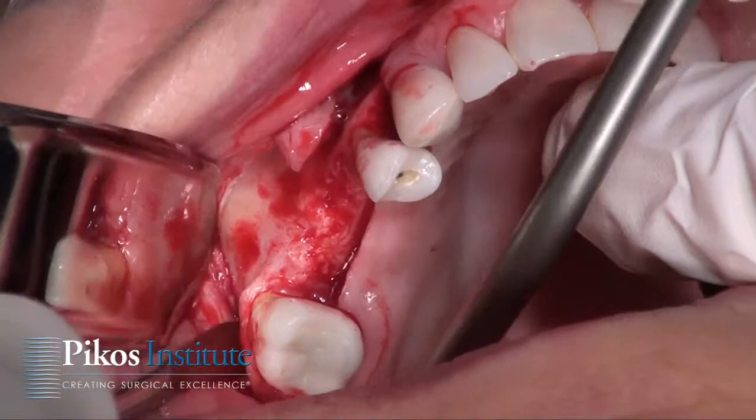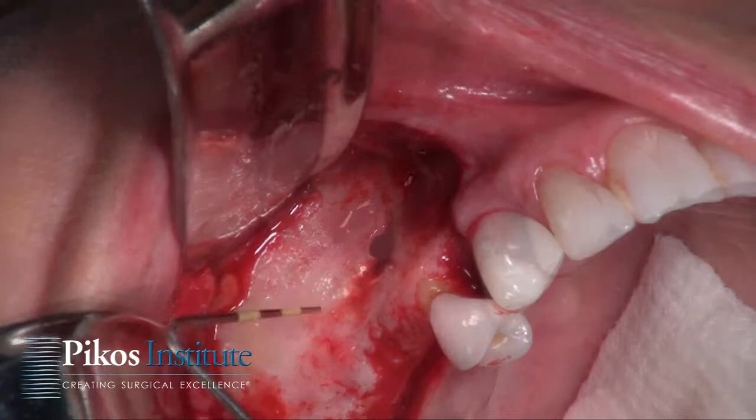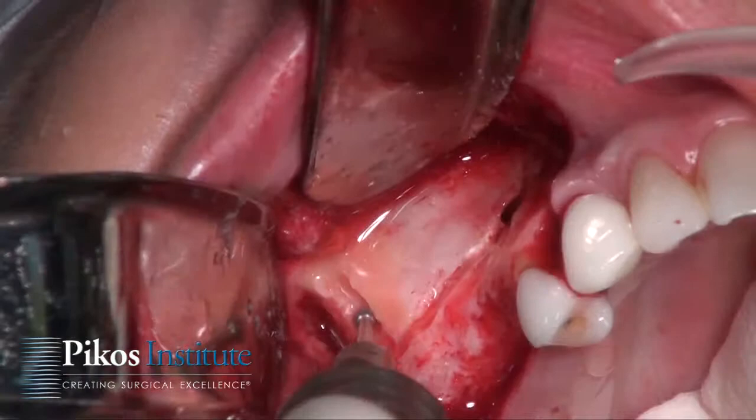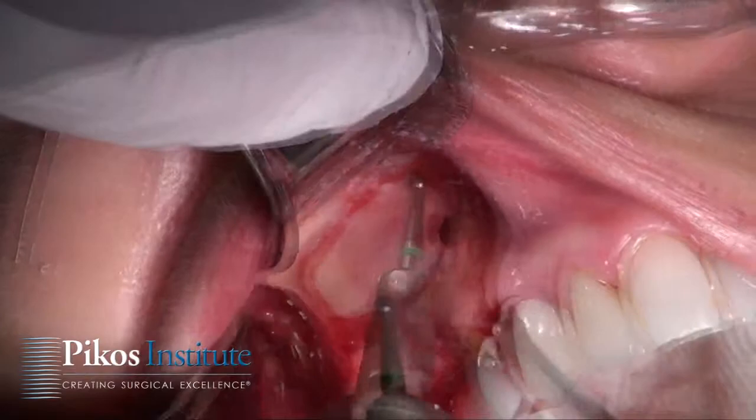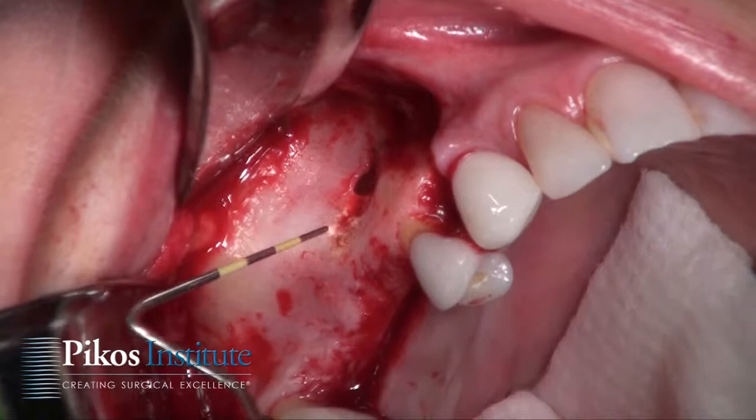You can see we've got a communication right here at the base of the bicuspid. So when I see something like this, especially in the area of where our window will be, I'll include that within the window itself. In other words, the window outline will include that small perforation, if you will, and therefore just makes it continuous with the osteotomy itself, the antrostomy, if you will. So no problem. It's just a nice thing to do if you see something like this at the apex of a root, for whatever reasons it's there, we'll incorporate it within the window.